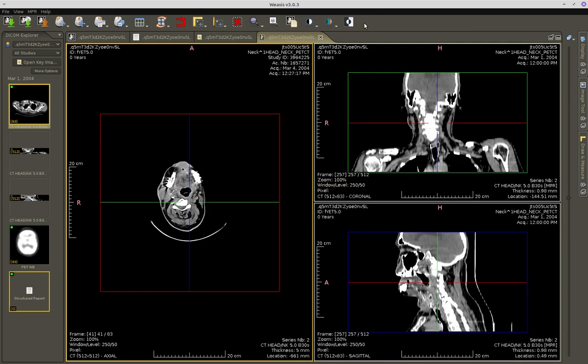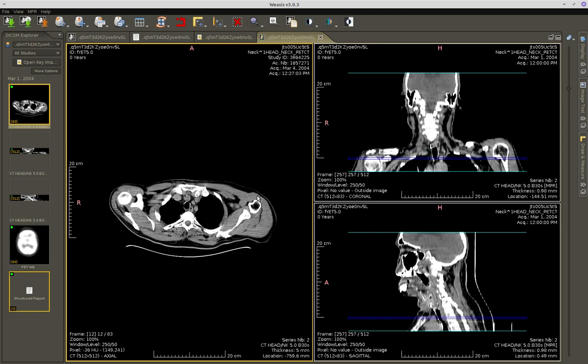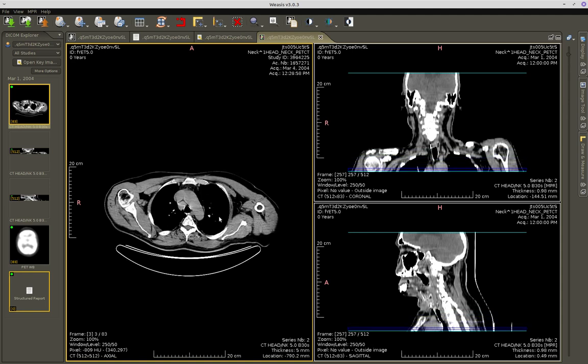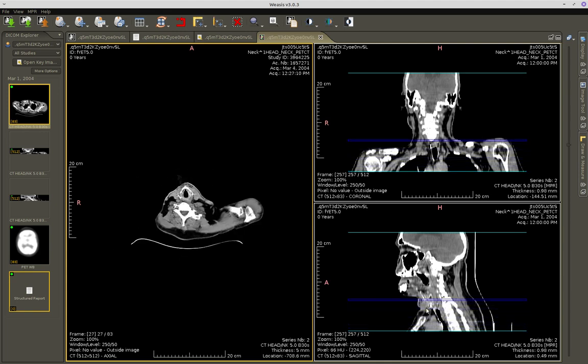Let's check this one. But you can generate a 2D reconstruction. So these images that you see on the right actually are not in the study. It's only the series, but because the series has a lot of images that are very close together, horizontal cuts, horizontal if the patient is standing. Here the patient is lying down, so this is actually vertical cuts. It is extrapolating these images on the right. It's good for reference, but it's not so good in terms of quality.